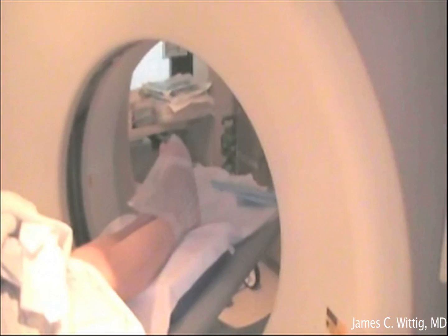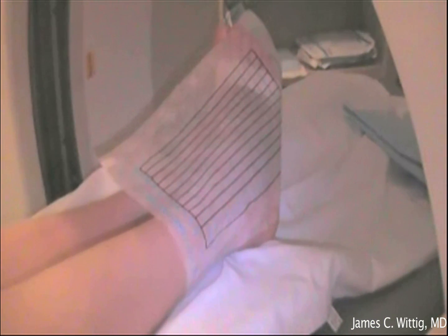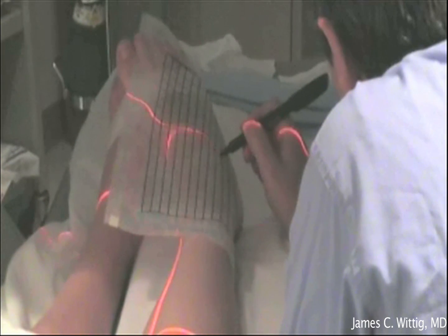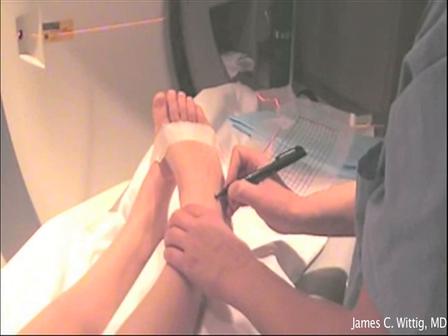Pictured here is Dr. Leon Ryback localizing the tumor under a CAT scan. A special grid is placed overlying the area of the lesion, and this grid is utilized to localize the tumor under the CAT scan. A special marking pen is utilized to mark the skin at the location of where the tumor exists in the bone.